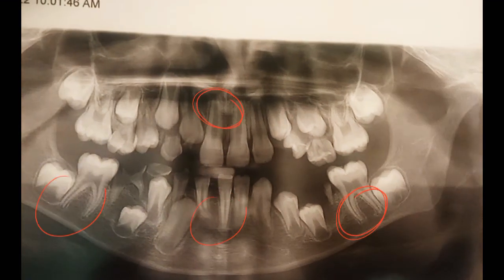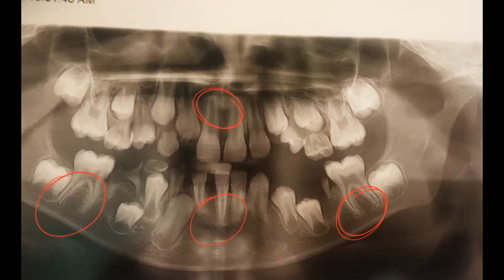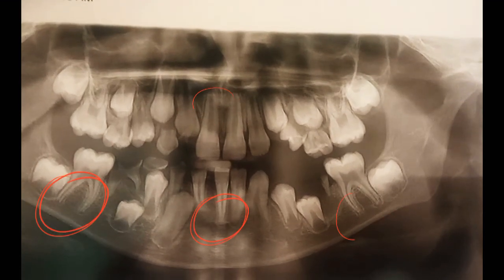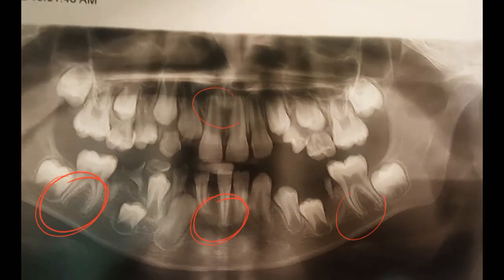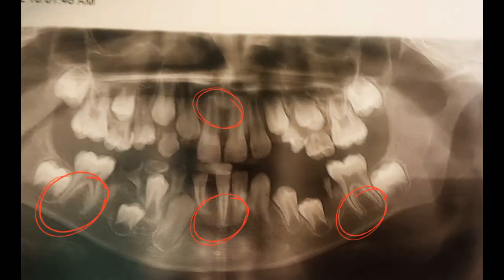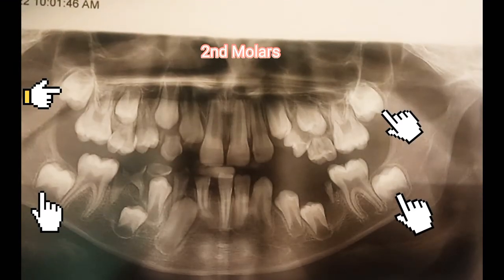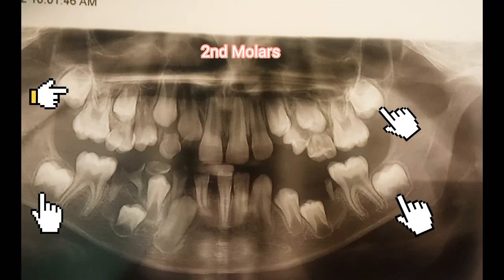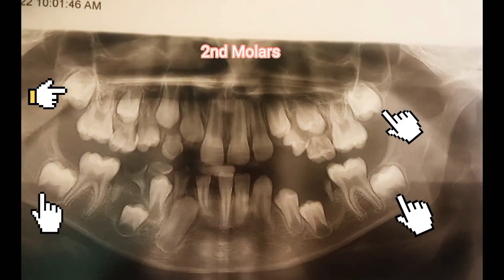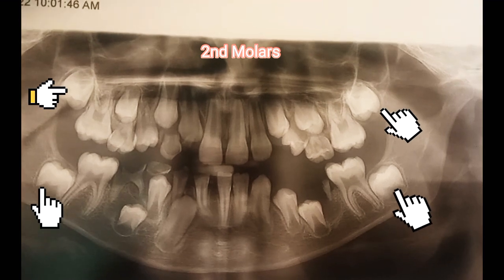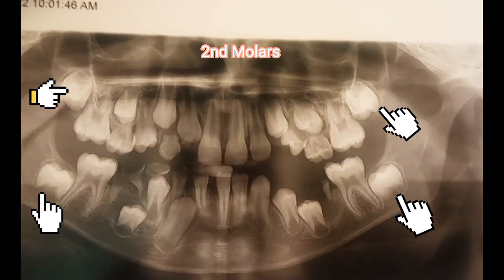Here you can see that the root completion of the molars and the central incisors, both maxillary and mandibular, is complete. Now here you can see the erupting second molars — only the crown area is complete and they are still root deficient.